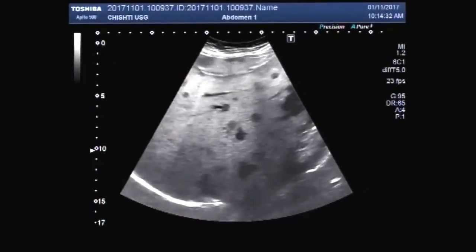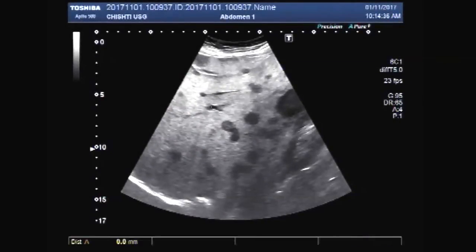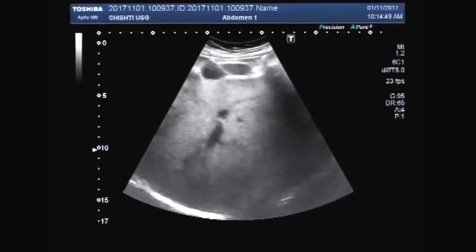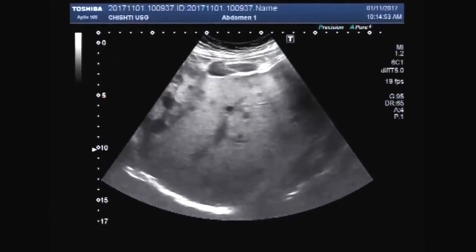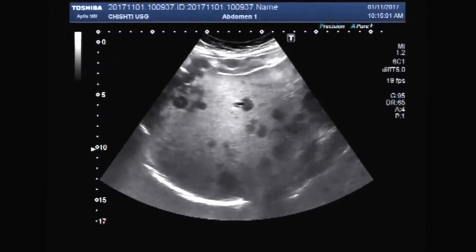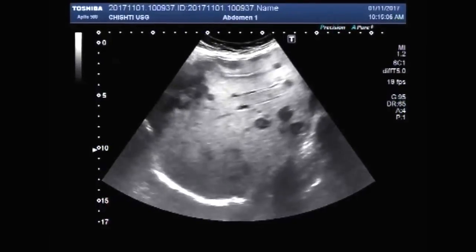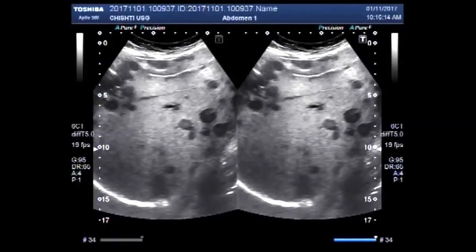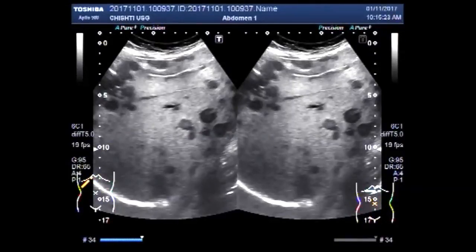You can see masses of varying sizes. There is no hepatomegaly.